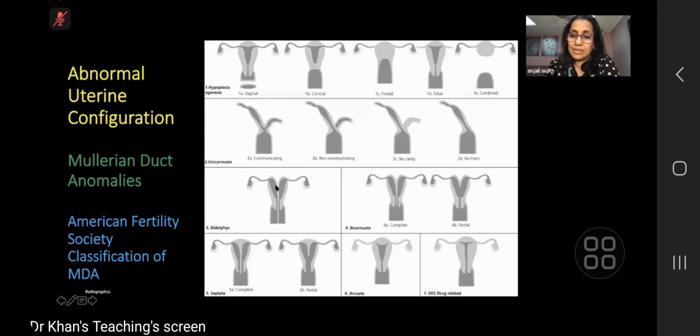It is heart-shaped. Same goes for bicornuate uterus, whereas in septate uterus, it has its normal convex contour. And so, hysterosalpingogram has limitations in showing the fundal contour. So you have to ask for an additional imaging which can show a proper fundal contour.